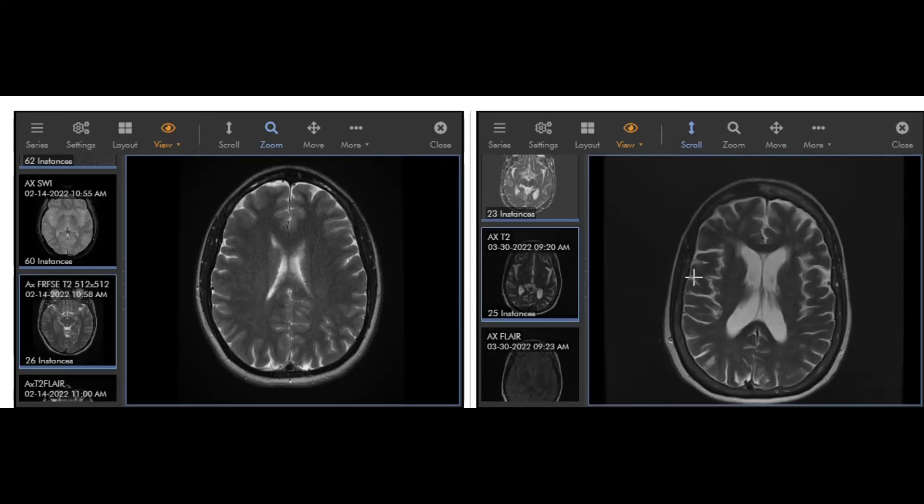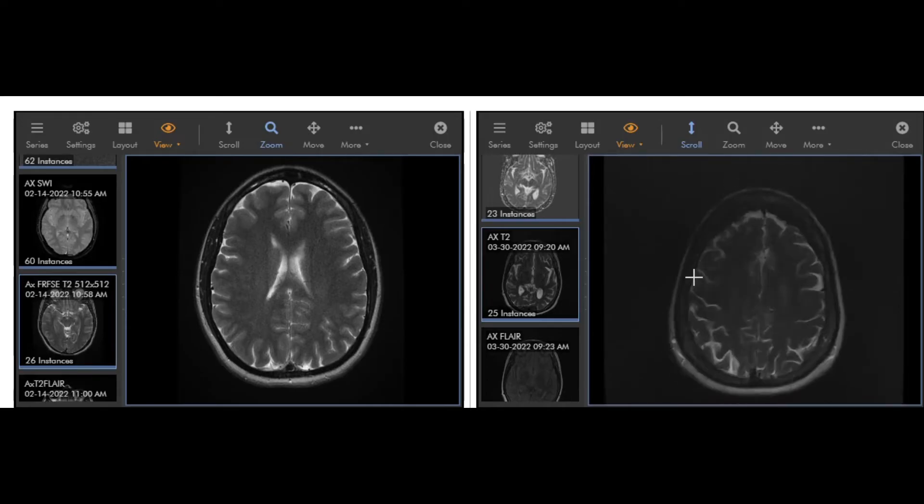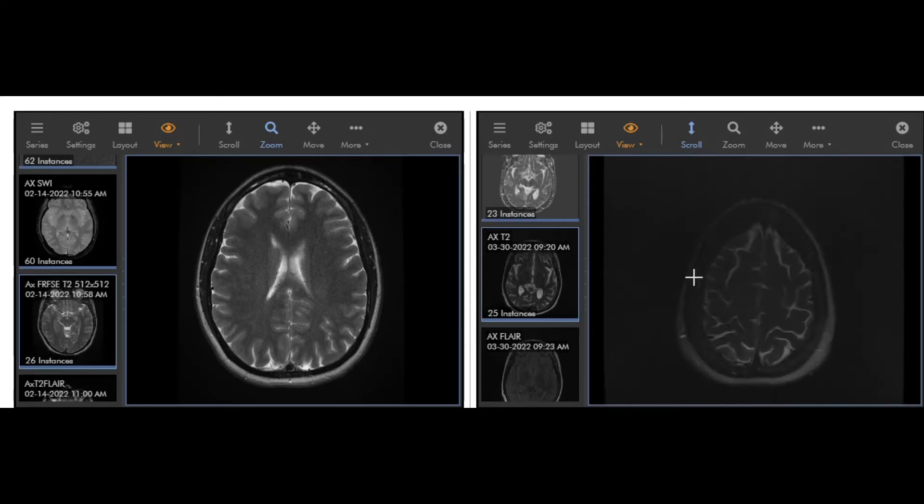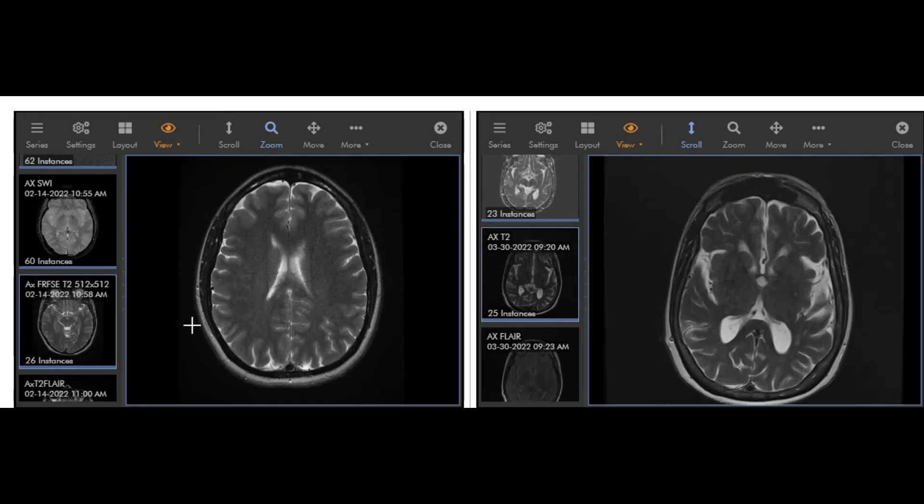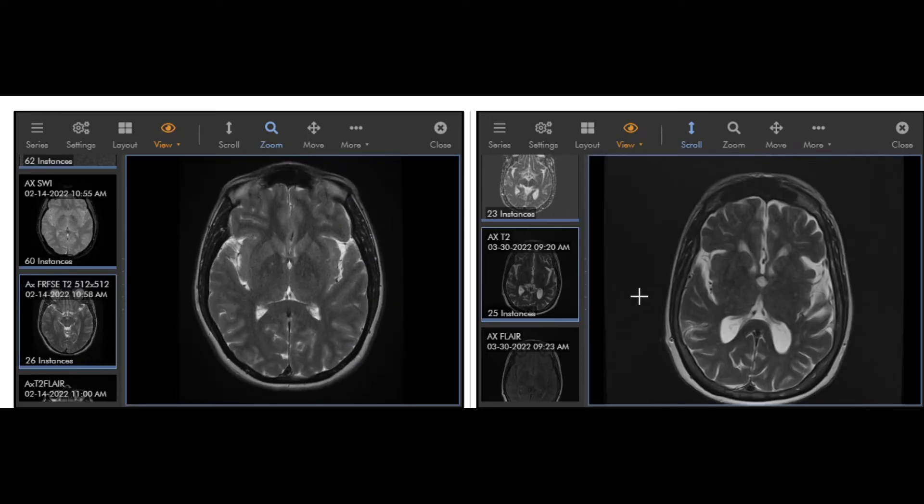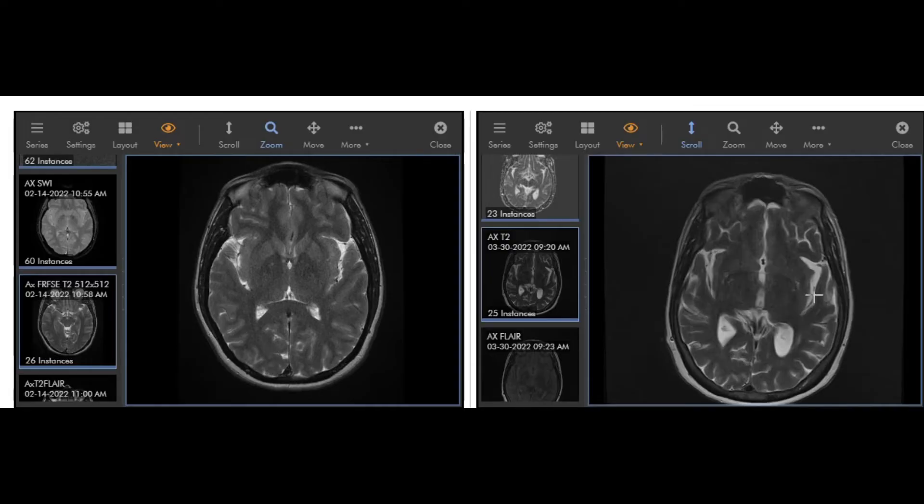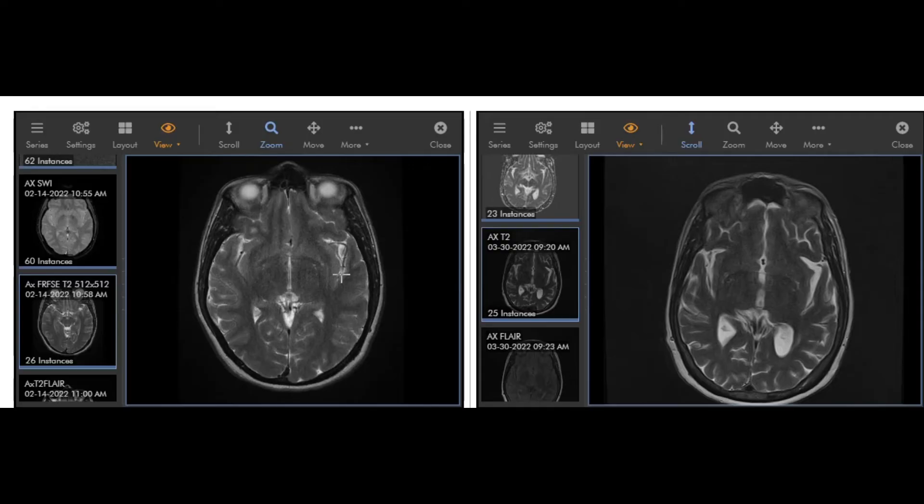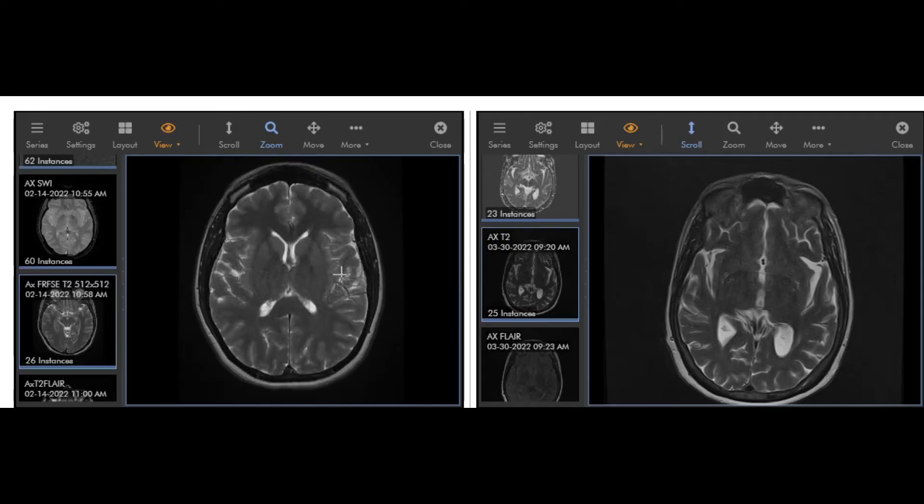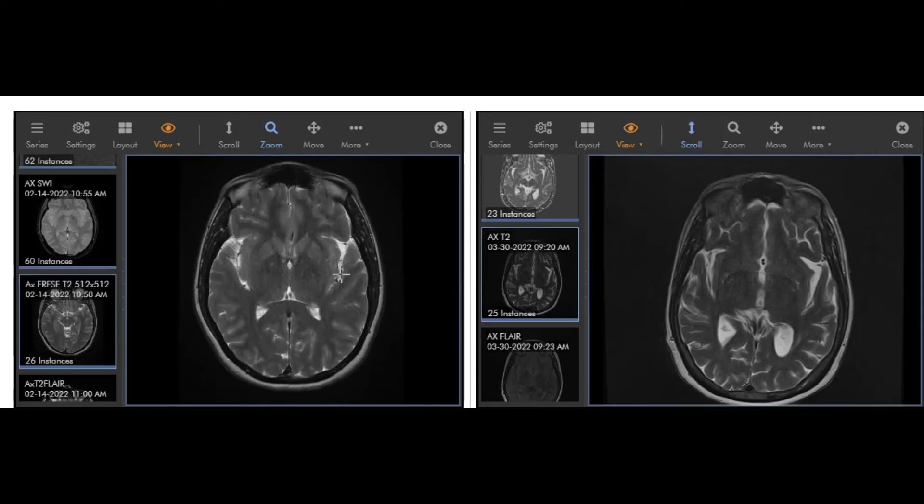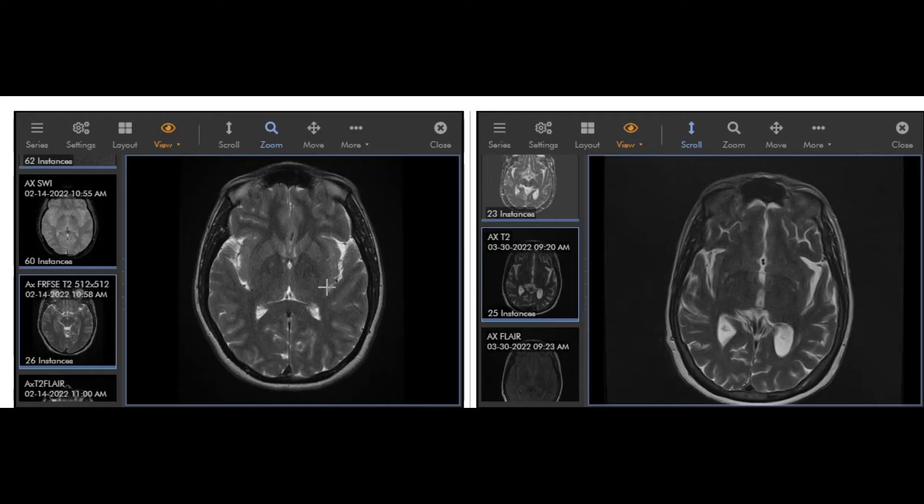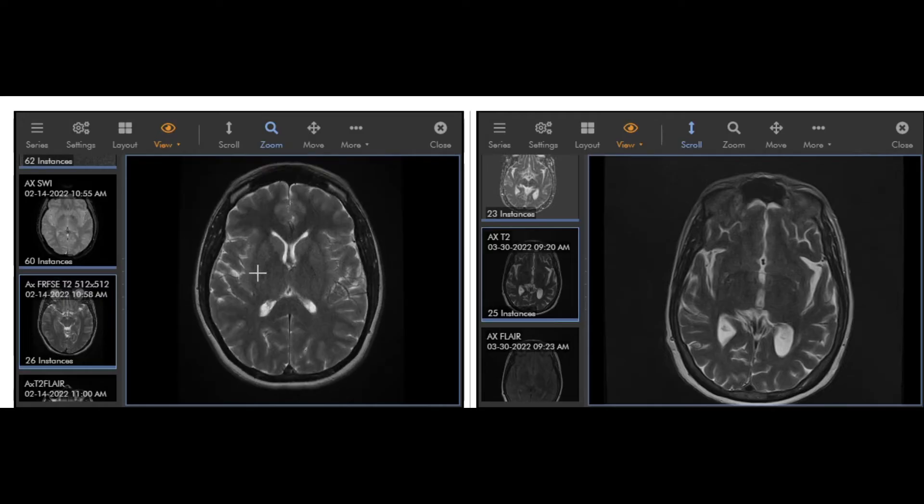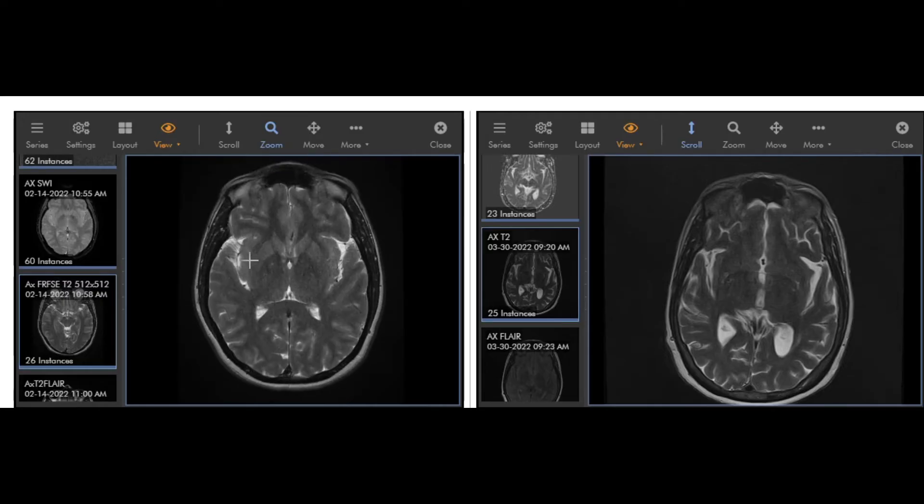But anyway, so this on the other side of the screen is actually a brain that looks somewhat similar, but it's starting to have a little bit of atrophy. So I want to show here, you can see this area here, there's a little more white in this area here. And you can see how it's basically the brain is almost touching here, but you can see this kind of crevice here, this is actually called the sylvian fissure. It's a large CSF space that goes between the temporal lobe and the frontal lobe and the deeper part of the brain here, which is the insular cortex.